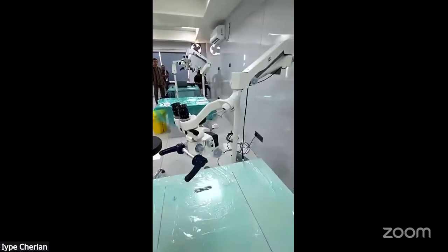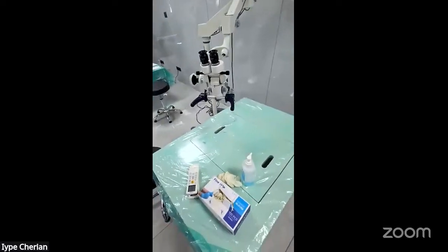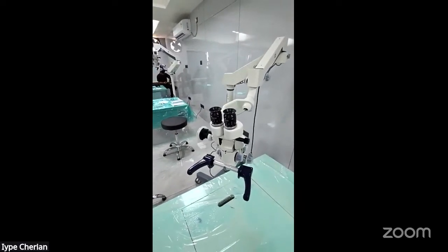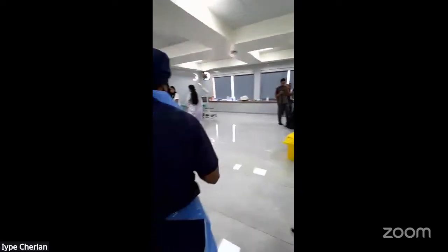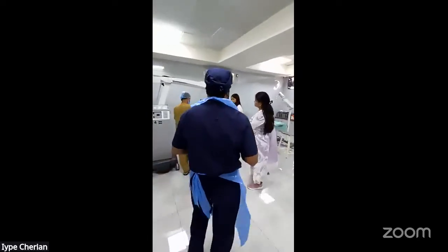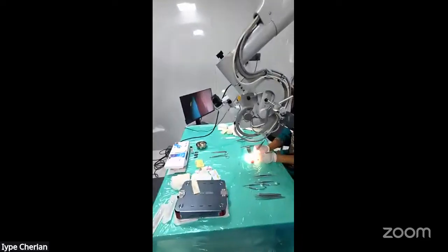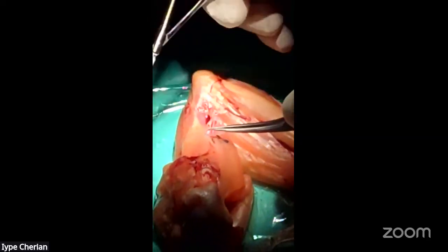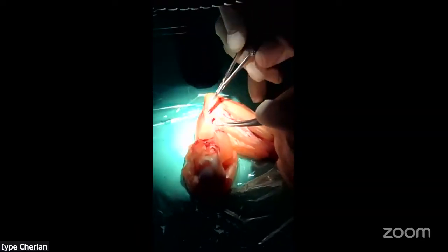So you can see we have stations over here for the various dissections. We have a station for vascular anastomosis. I will show you, come here please. This is the station for vascular anastomosis, where with a chicken wing we can do hands-on training.